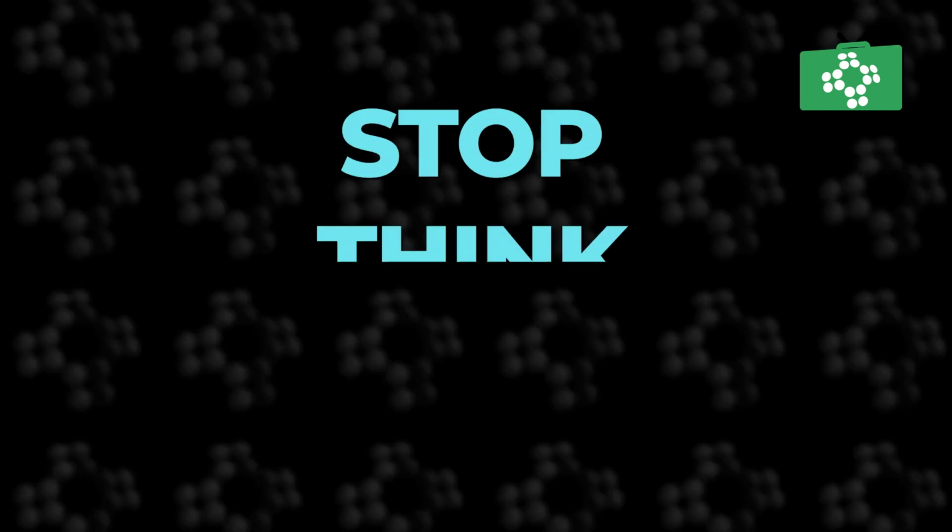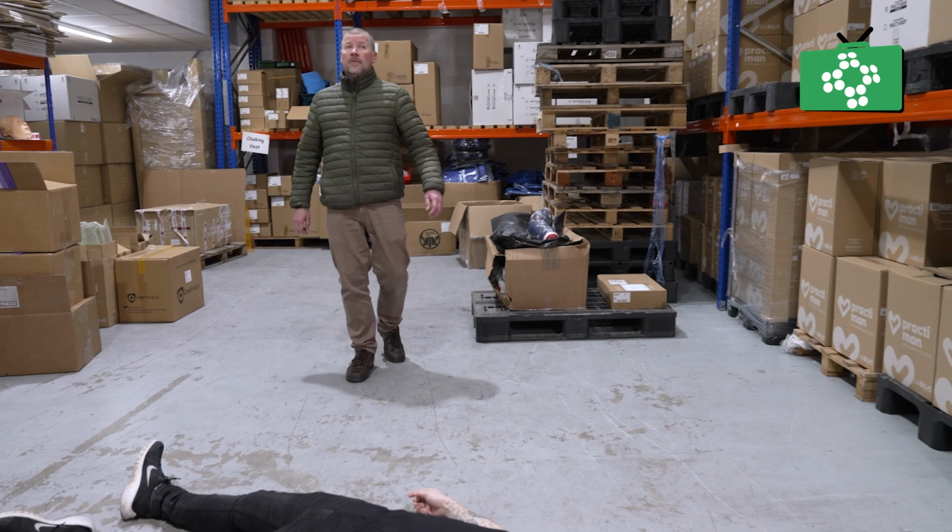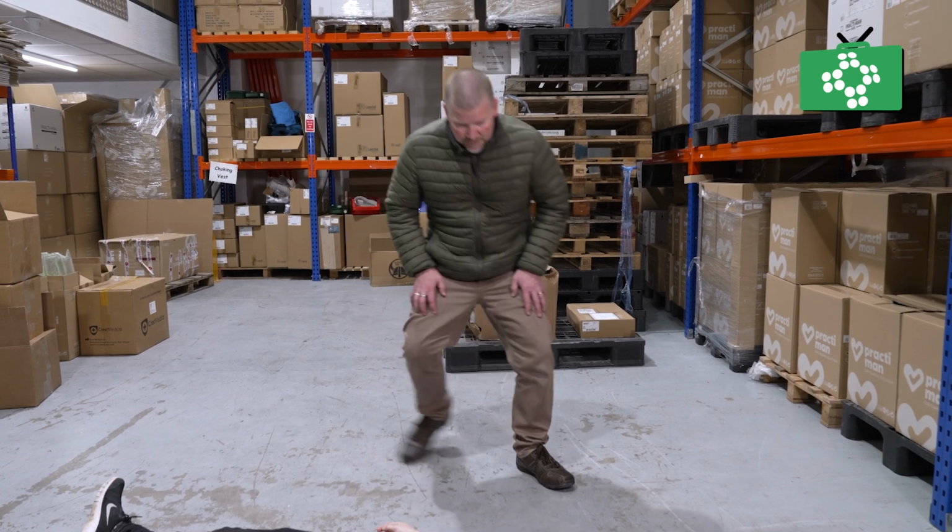Firstly, we need to approach and check the scene for anything that could harm us. Stop, think and act. If available, put your gloves on. But as there's not a high risk of infection and time is critical, we don't waste time looking for them.